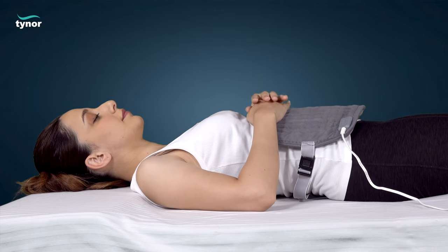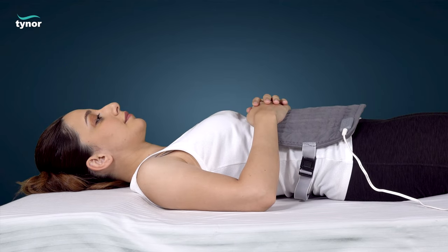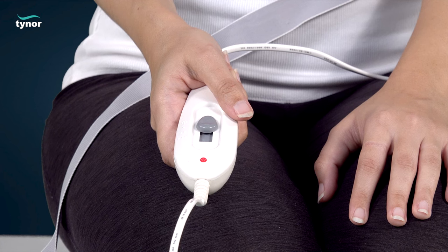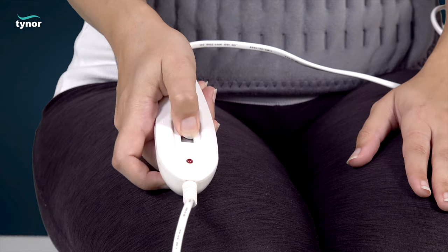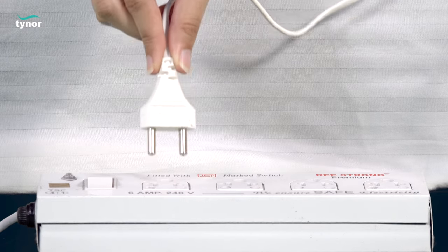Please note: settings 2 and 3 of the controller provide the same heating levels. Adjust the regulator to a comfortable heat level. After use, switch off the pad, remove it, and place it back in its storage location.